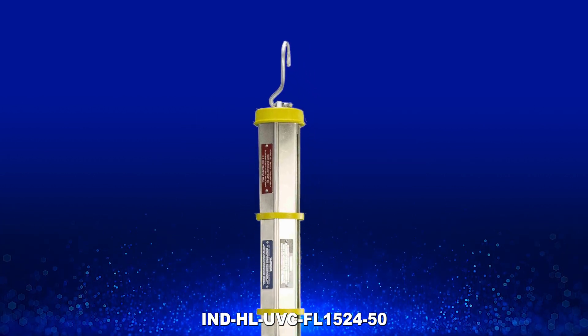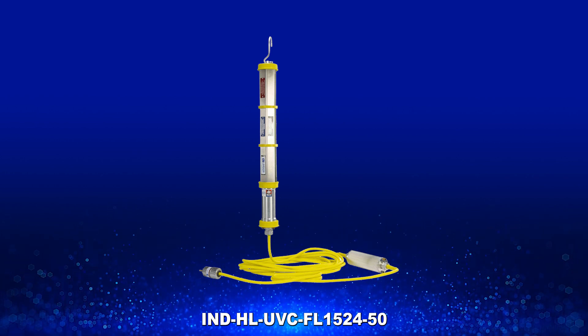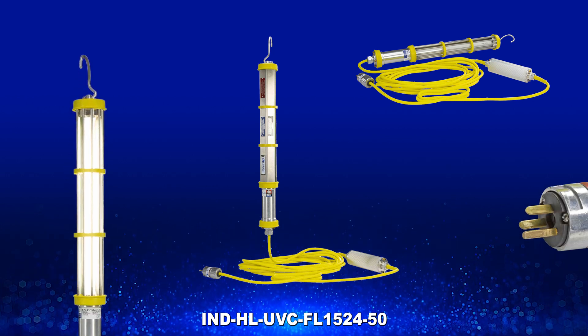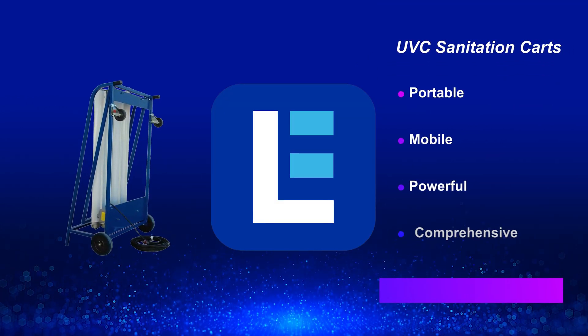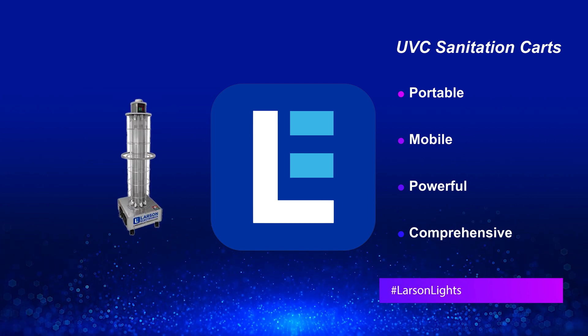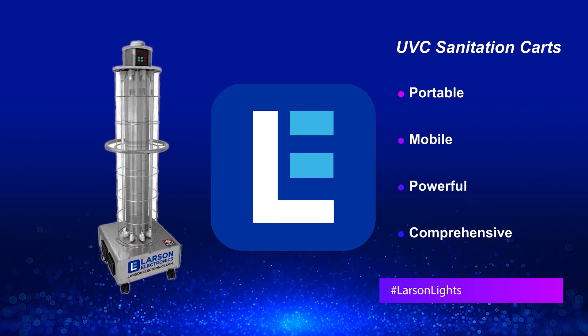A longer version of the IND HL UVC FL 2650 is also equipped with 50 feet of 16-3 SOOW cord and a general area cord cap. For large facilities and sites, check out our UV sanitation carts equipped with several UVC lamps — these mobile units provide complete disinfection of entire rooms.